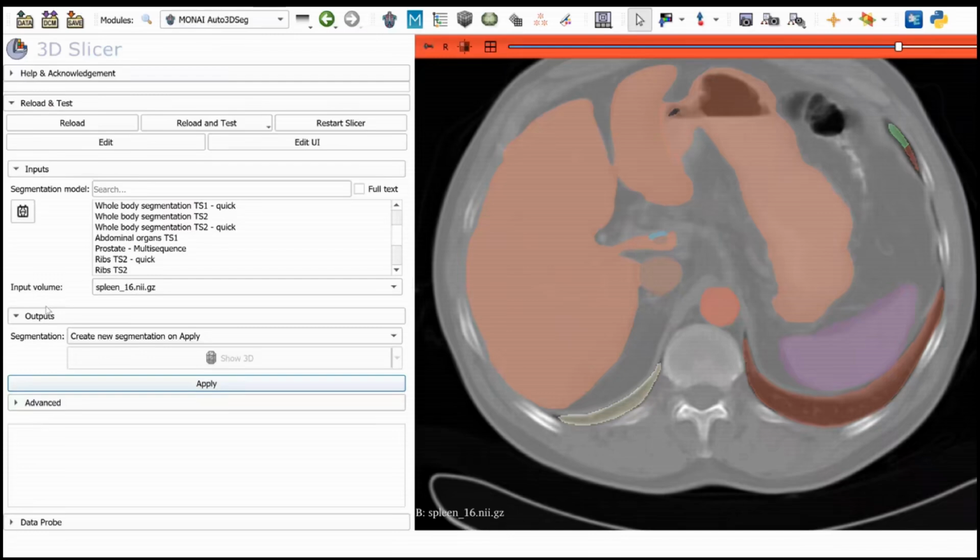Yes. Can we create a customized segmentation, or can we use the already existing ones? Like I'm used to doing that in Python. Like how much training would be required? Yeah, it's a good question.